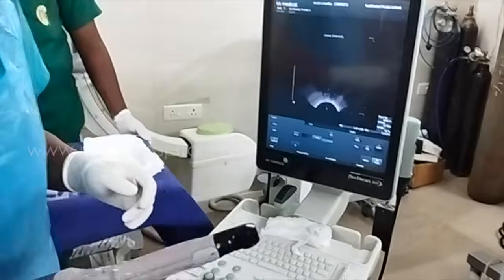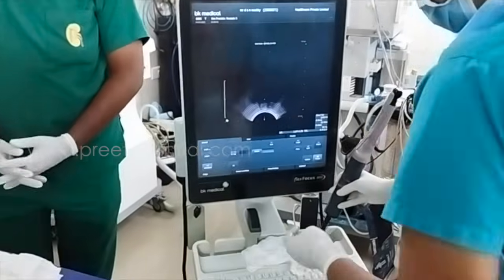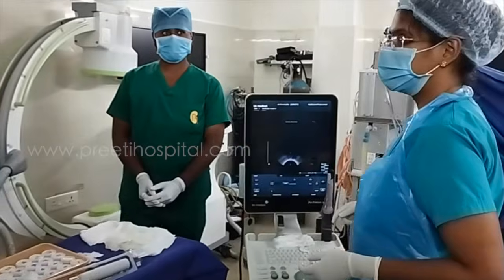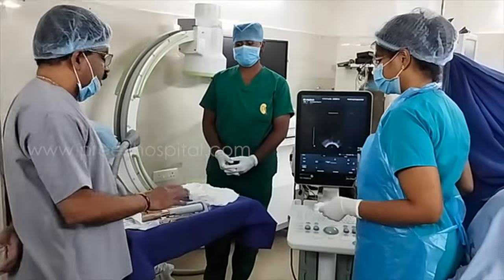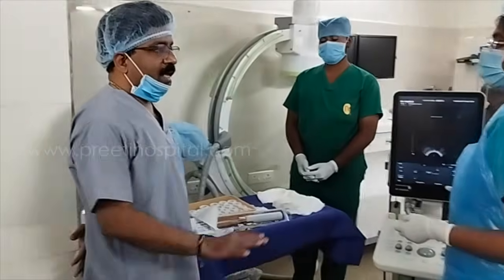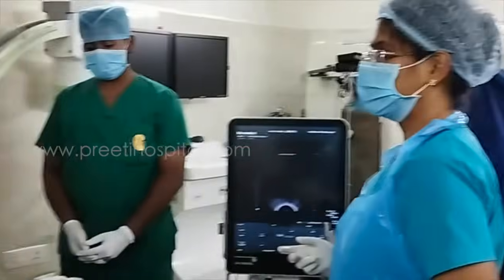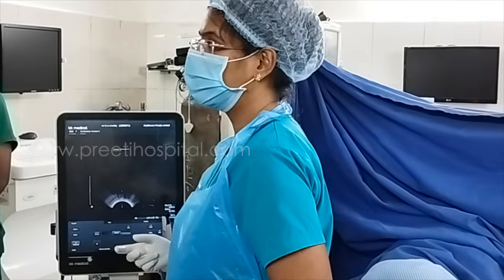Now what about the other things, once you keep the probe there? It has to be done under sterile conditions. Do you give a proctolysis enema or one plain Dulcolax or nothing? We give Dulcolax for 2 to 3 days pre-procedure and one antibiotic for 2 days before.